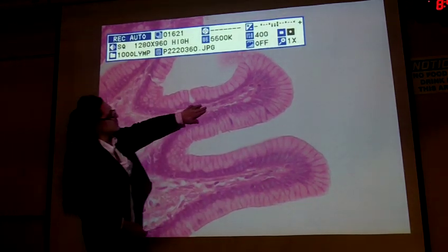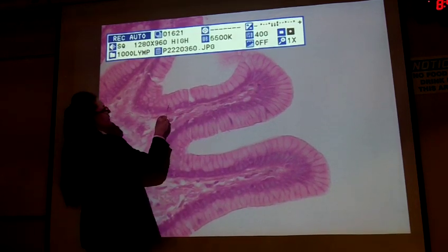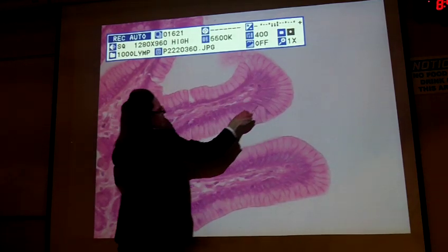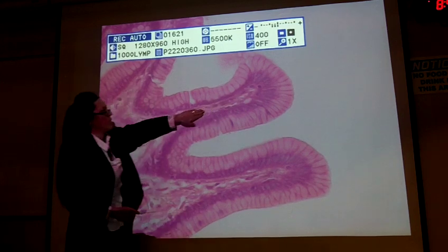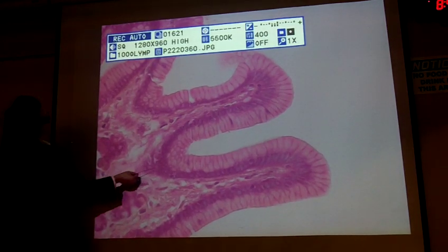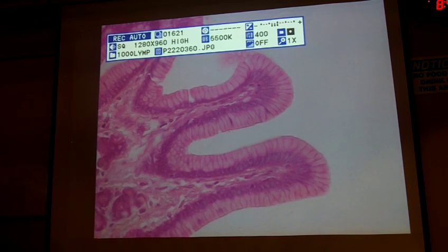And you can see in the middle here, this is just connective tissue, where this layer of epithelia and this part of the epithelia are just connecting to this lamina propria right here, that connective tissue. And then at the base, I'll pull this up and you should be able to see gastric glands down here.